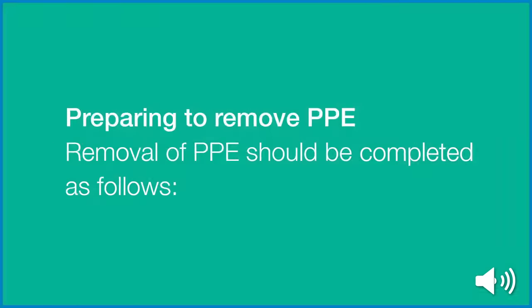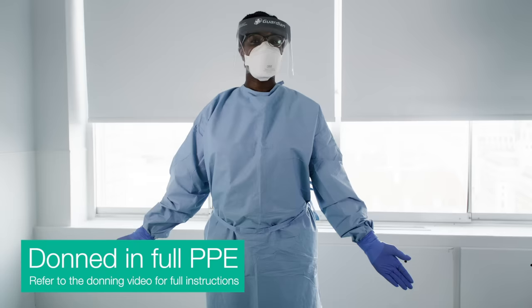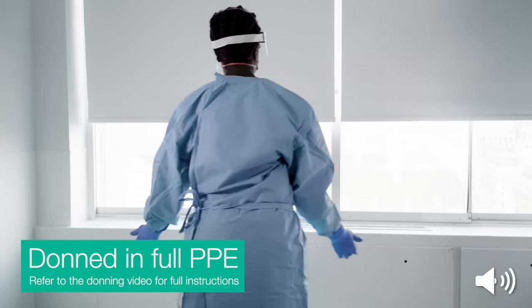Preparing to remove PPE. Removal of PPE should be completed as follows. Do not step into the clean area wearing contaminated PPE. If aware of any PPE breach or high exposure contamination to PPE, inform the buddy before removing any PPE. This is Cecilia, who is donned in full PPE. Refer to the donning video for full instructions.